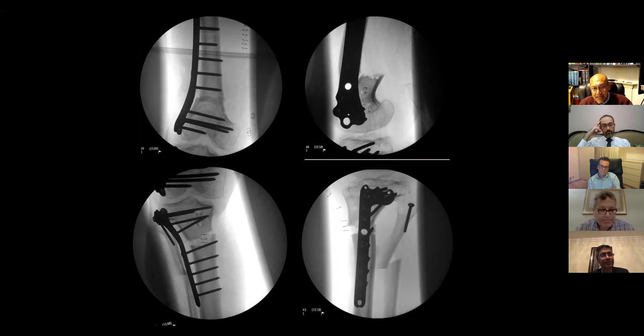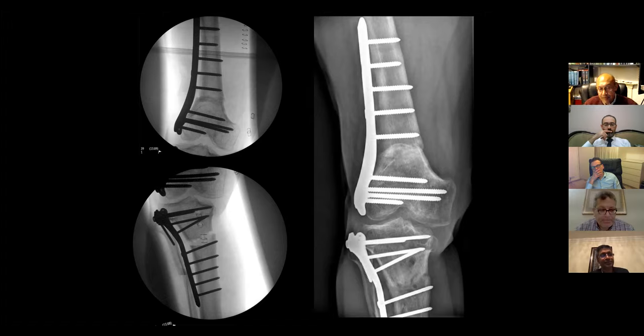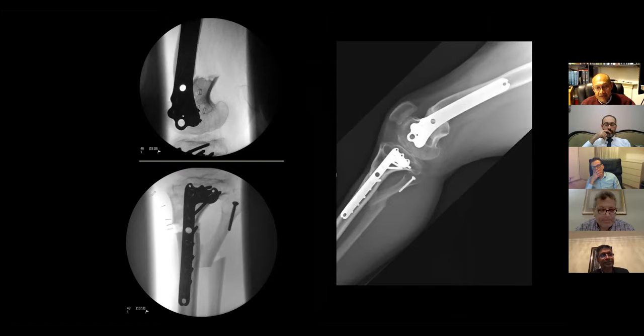In the tibia, there is less, but there is a significant anterior open wedge osteotomy, understandably because it was a recurvatum deformity. In both these instances, the osteotomy was done percutaneously, preserving the soft tissue sleeve as best as one can. This is really important because if you perform and maintain this tissue viability, even big areas of translation will form callus. So as in this case, you can see the postoperative x-ray, this is without bone grafting, healing occurring sometime in the middle phase of recovery. And this is the postoperative lateral view showing consolidation after union of the osteotomy.